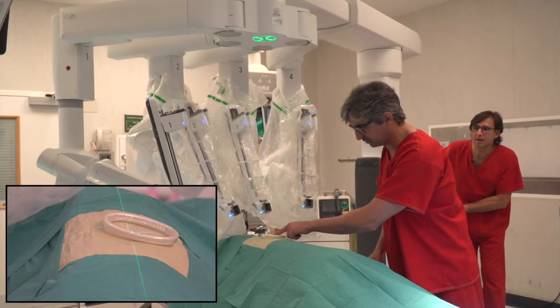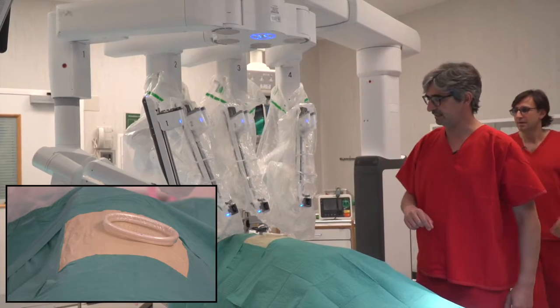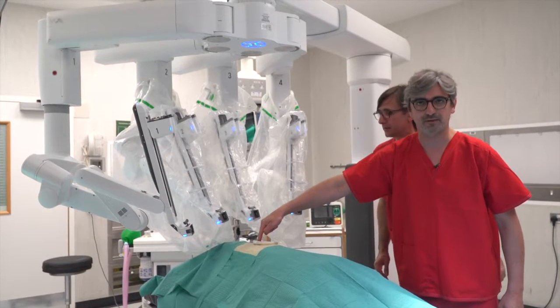Deeper, more — keep moving. Okay, stop. You can see here: perfectly place the cross on the posterior part of the incision. Very important.